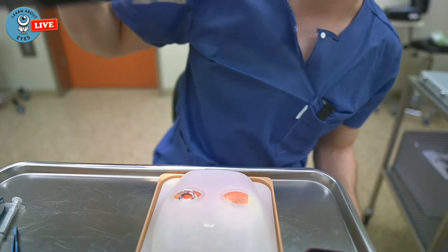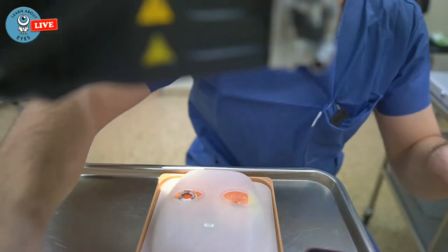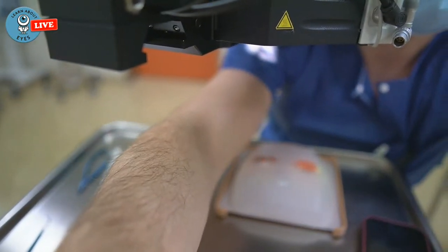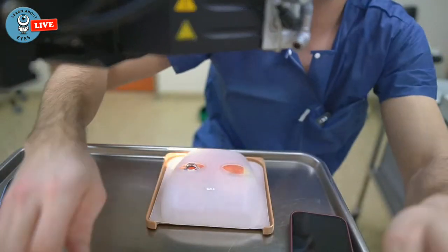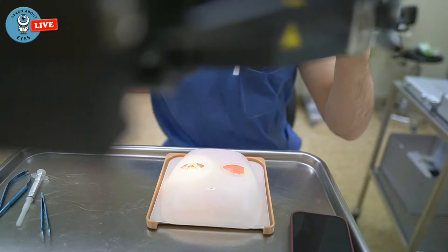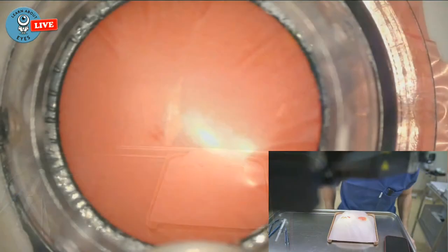Now I'm trying to get the microscope around the camera. That's pretty hard to do because it's so big. Let's put this like that. Okay. I think this should be fine. And then I'll switch to the microscope view.